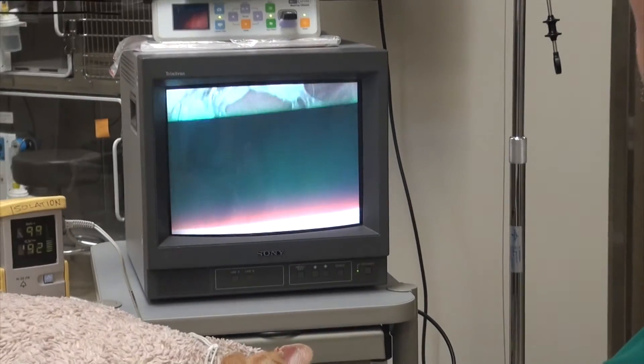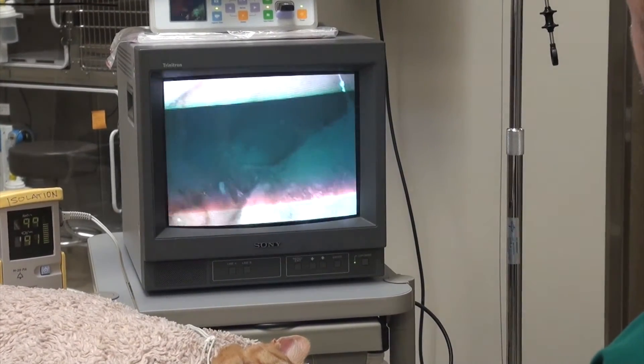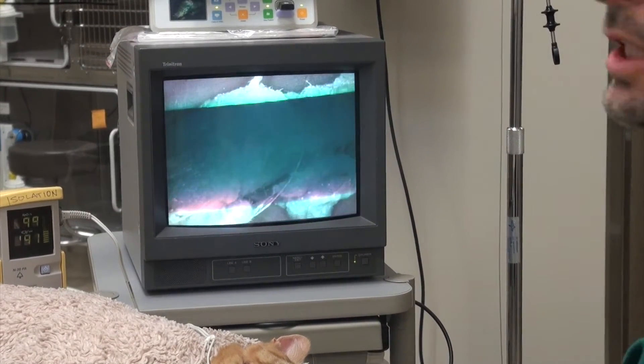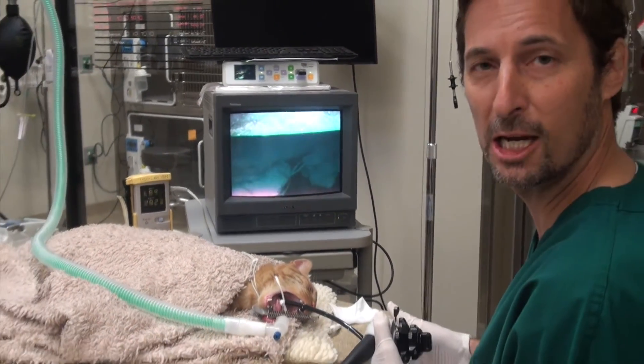Now you can see a little bit of the gastric fold still, and then if you look right there, there is the foreign body. It looks like the owner told me it was a blue piece of yarn, and I can see that it actually does look like there's a blue piece of yarn in there. Awesome, let's take it out.